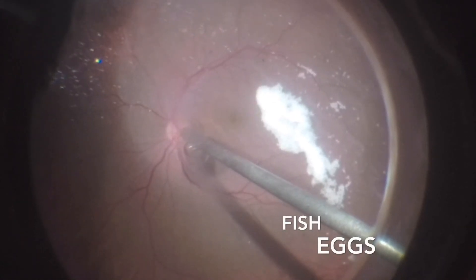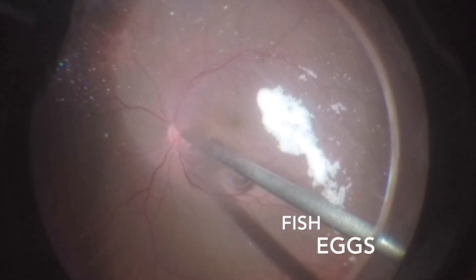Small bubbles of PFCL are a risk for subretinal migration, especially in cases of traction, PVR, retinectomy, or large retinal tears.